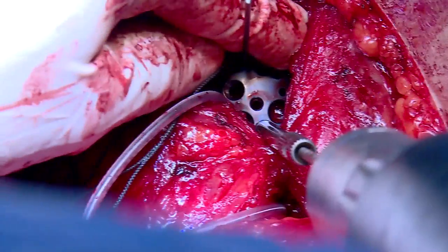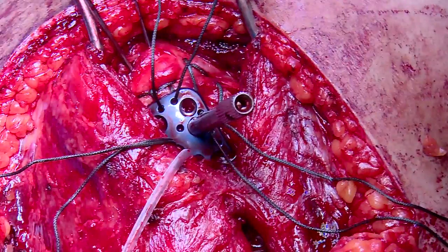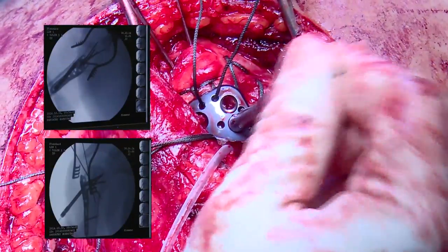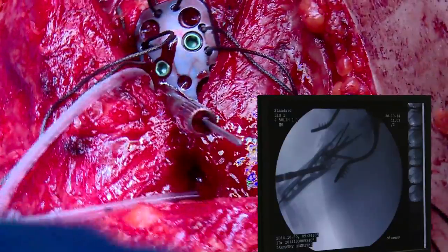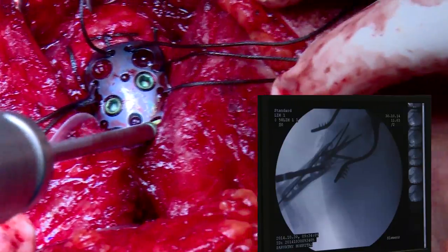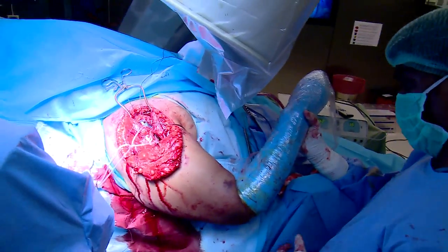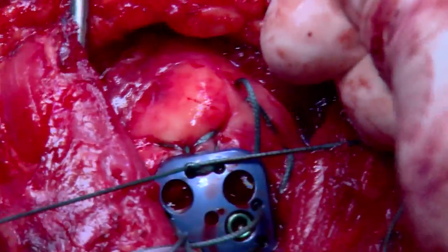After confirming the position of the calcar screws in the anteroposterior view, the proximal portion of the plate is typically fixed first with multiple locking screws. Screw placement into the humeral head should be as subchondral as possible and confirmed with sounding and fluoroscopy. The diverging screws in row C of the PHILOS plate should be carefully placed into the humeral head to avoid intra-articular penetration. The inferomedial calcar screws, which are important in resisting varus deformation especially in 3 and 4-part fractures, should be placed as inferiorly as possible. Finally, the traction cuff sutures are secured to the plate to complete fixation.